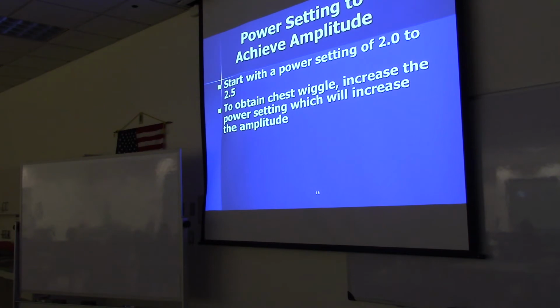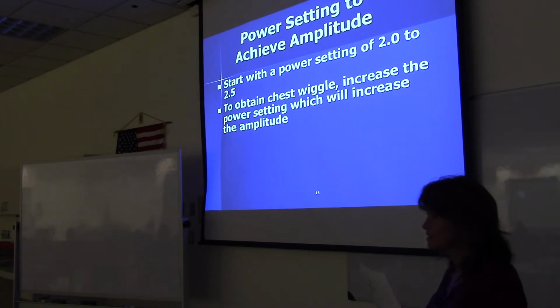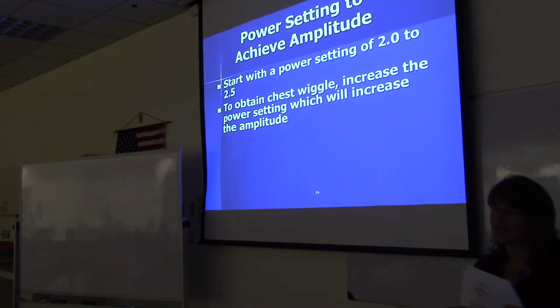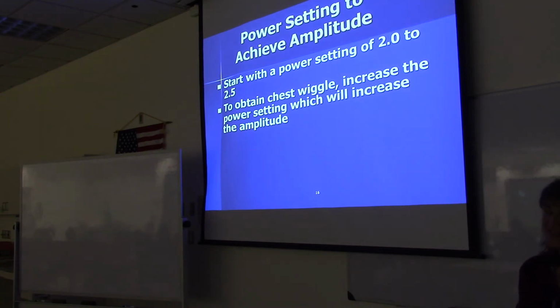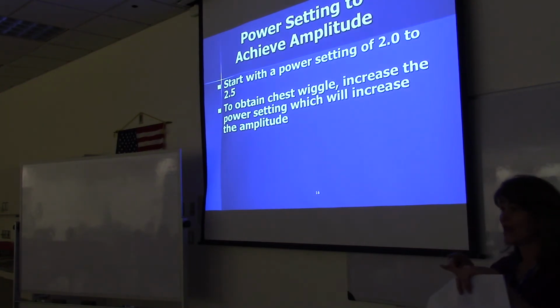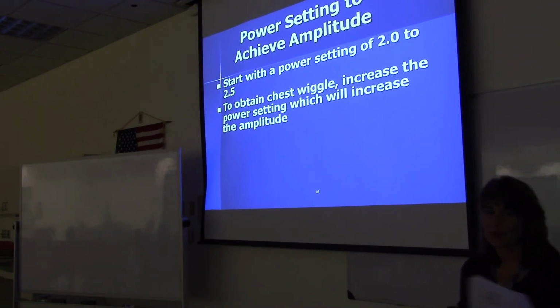So when you walk up to the oscillator, you don't have an amplitude setting, but you have a power setting. And the power setting tells that diaphragm how hard to push the air. So it's a power setting. But then you'll have a digital readout showing the result or the amplitude, but you're actually setting a power.